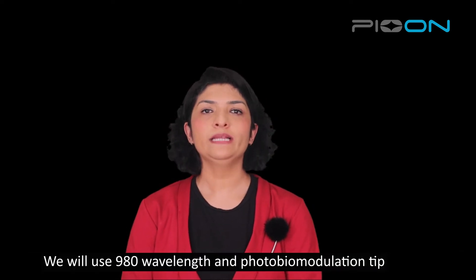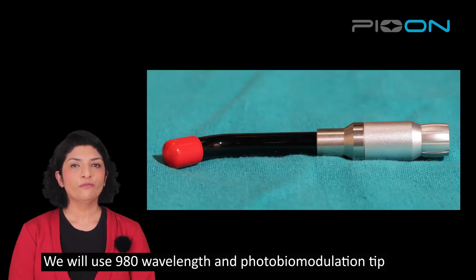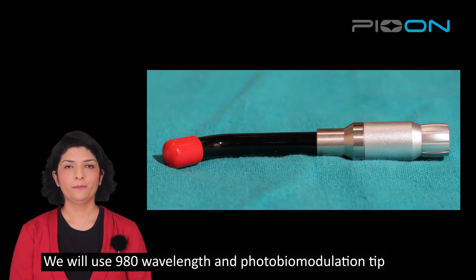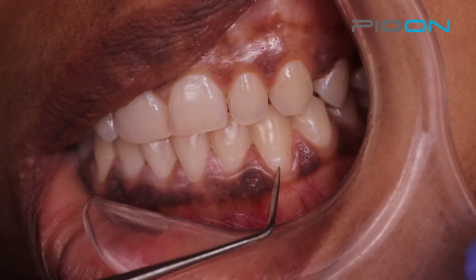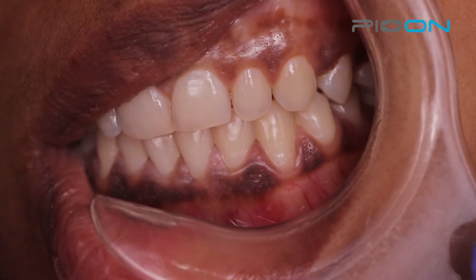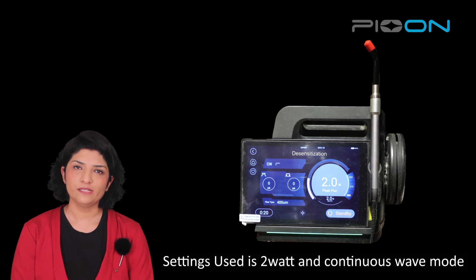We will be using 980 nanometer wavelength and a photobiomodulation tip. This is our concerned area. The settings used are 2 watt and continuous mode.